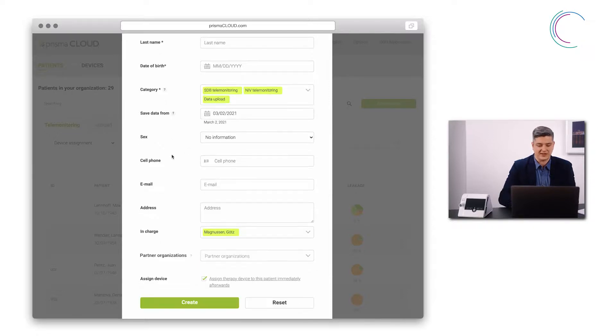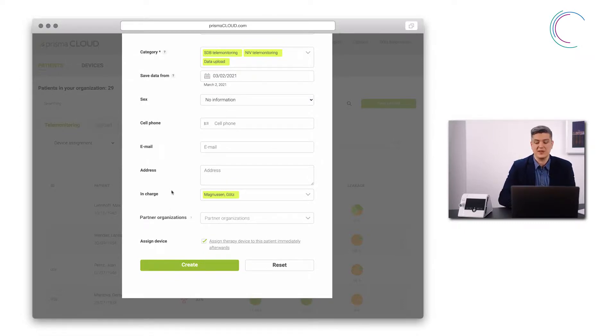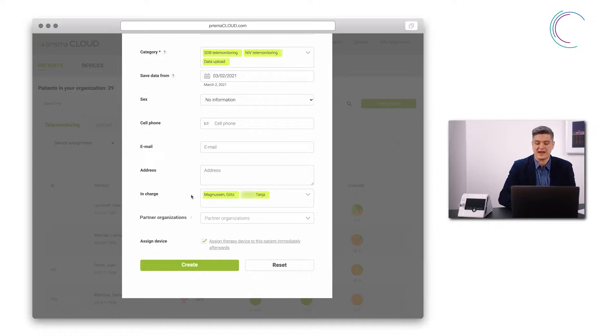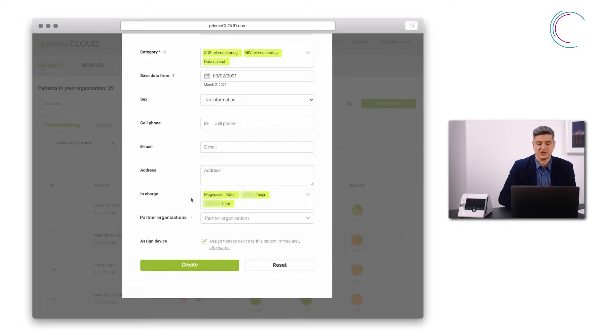Sex, cell phone, email and address are clear again. With in charge I can define who is in charge of this patient. I am pre-selected as I am the one who is creating this patient here. I can create additional users to manage the people who are in charge here.